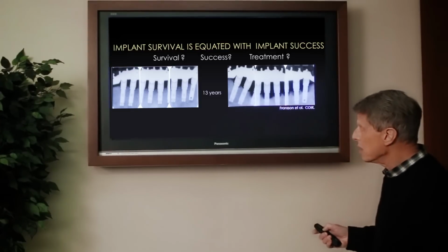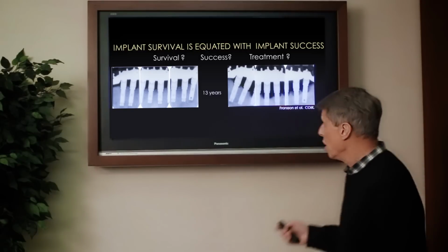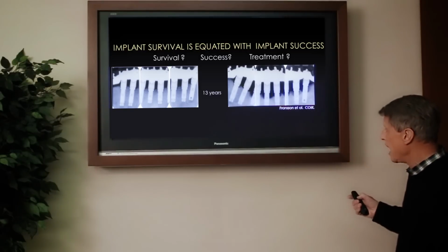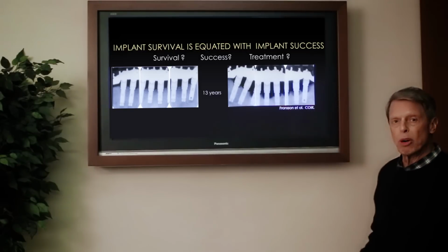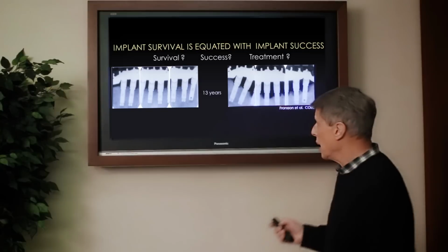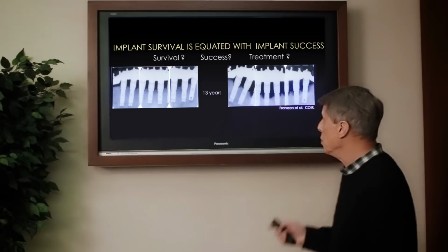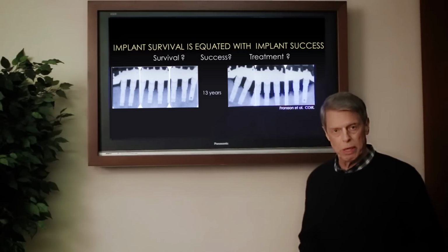So if we take a look at these implants over here, these implants were placed 13 years ago. When we take a look at them 13 years afterwards, we can see the amount of bone loss around the implants. Now, they definitely survived, but I'm not quite sure we can call these implants a success, but I do know that they definitely need treatment.